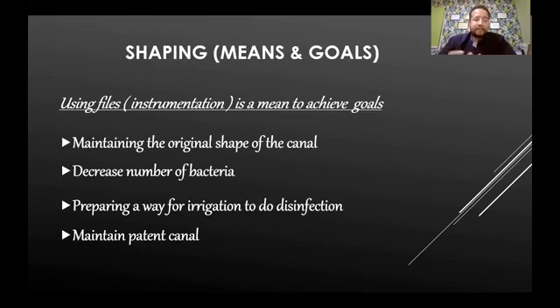Because if you have a room full of furniture and you want to clean the floor, what's easier and more efficient: to empty the room of all the furniture and clean the floor, or to clean the floor while the furniture is in the room? So patent canal, you should concentrate on having a patent canal after shaping. Let's see some shaping protocols.